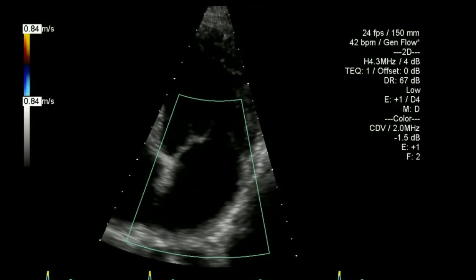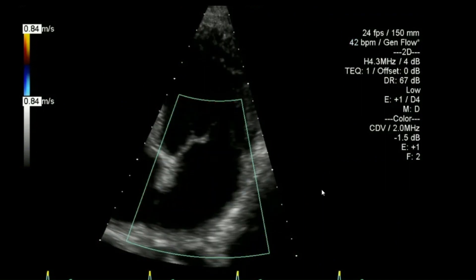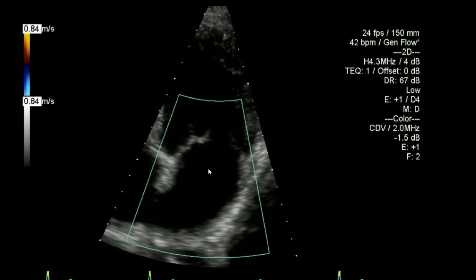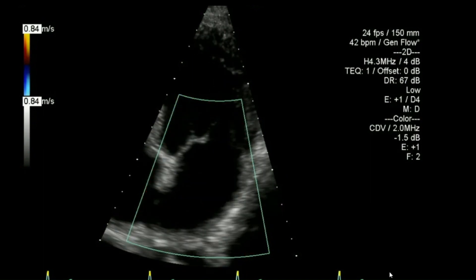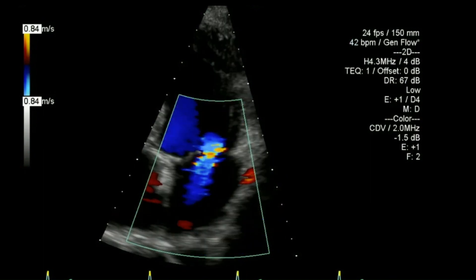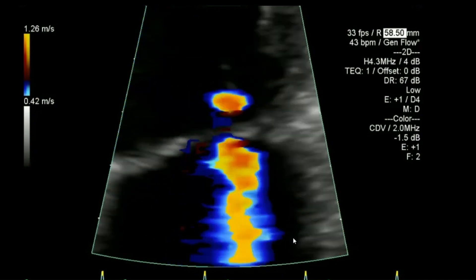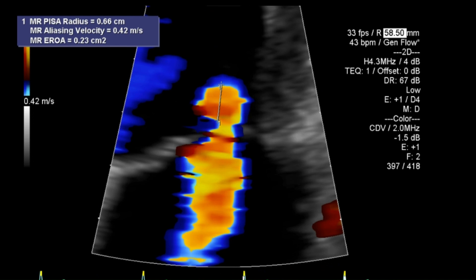Now focusing on the mitral regurgitation, trying to keep frame rates at 25 fps or above, having the colour box wide enough to see anything else going on and also see forward flow. There was a little bit of mitral regurgitation so I did apply the colour Doppler in consideration of doing a PISA assessment, and we can see that little dome there which I have measured.